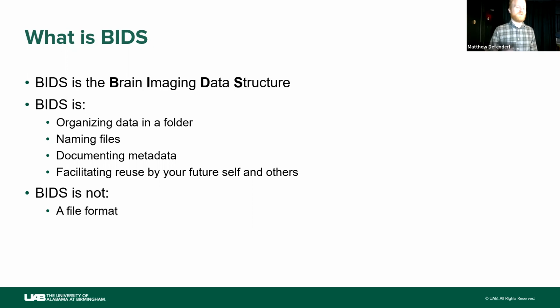BIDS is not a file format. So you are not converting from DICOMs to a BIDS file. There's no such thing as a BIDS file. You convert from DICOMs to NIfTI files that are structured in a BIDS format. And it is not a data sharing platform. And it is also not a pre-processing or processing pipeline at all.